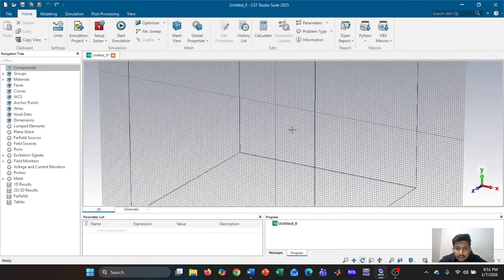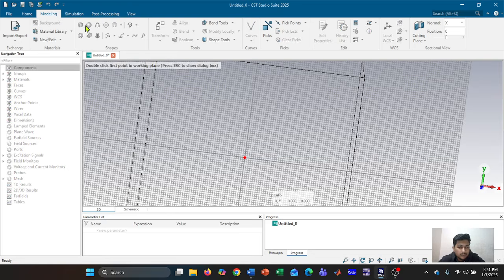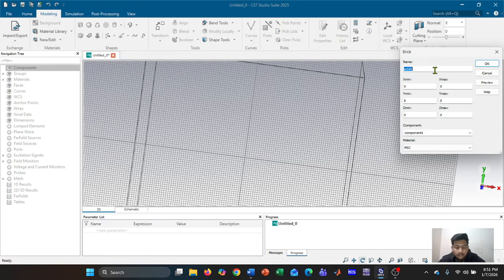Okay, so this is the simulation page. I'm going to design this antenna inside the skin. So let's first of all design the skin material. I will select the brick, escape. I will name it skin. The x minimum would be minus 100 by 2, x max 100 by 2, y minimum is also minus 100 by 2, y maximum is 100 by 2 and z maximum is also 100 by 2, and the material would be skin.